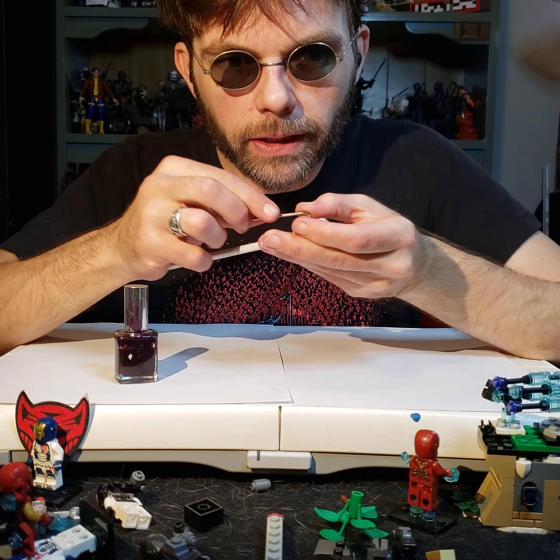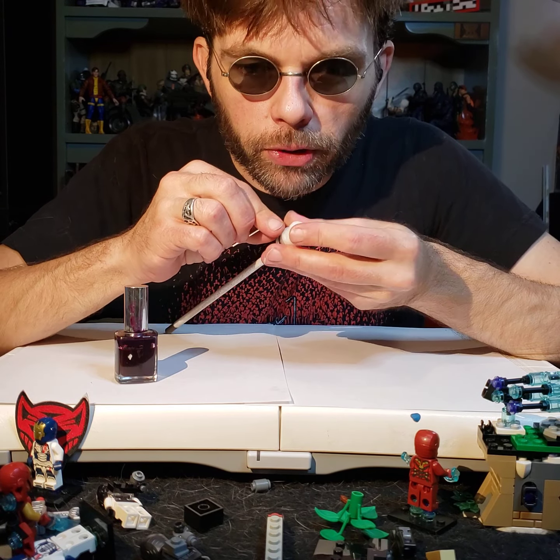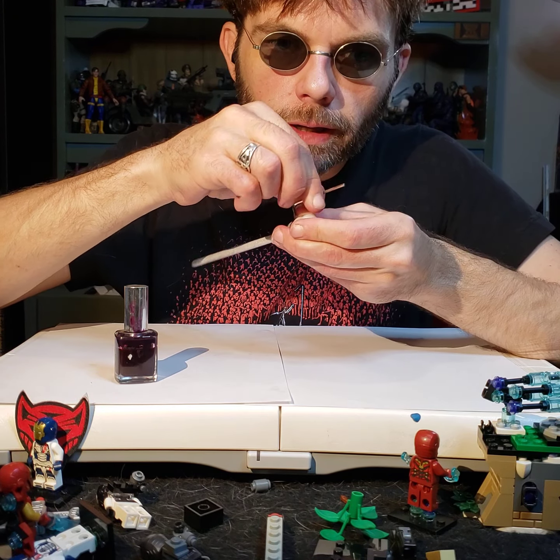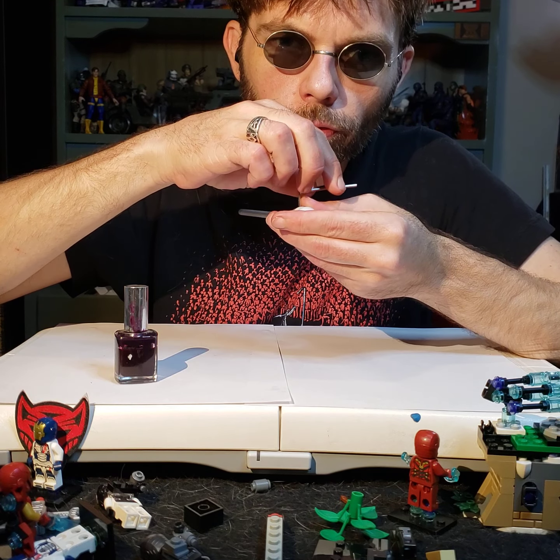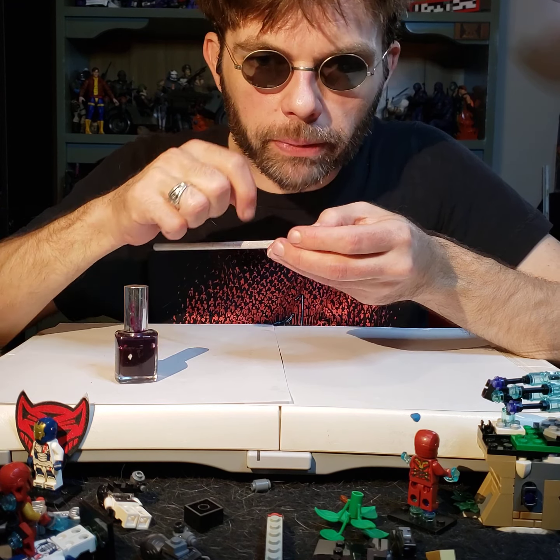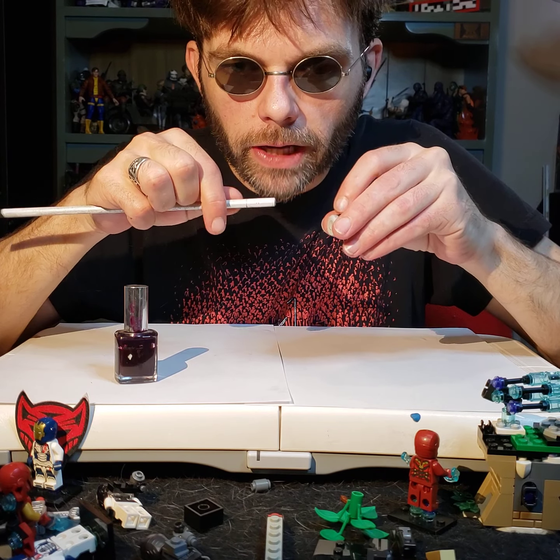But once you get it in there, I suggest using the small end and using this long end of the Allen wrench because they're shaped in an L. So put the short leg of the L into the socket, and then use the long leg of the L like a lever. Now do it. Let's see. We'll do 2 full rotations, and we'll stop. Okay, because you don't want to do too much. You don't want this screw popping out. Lord help you if it pops out. You just need 2 full rotations, and then you can pull the entire end of this out.